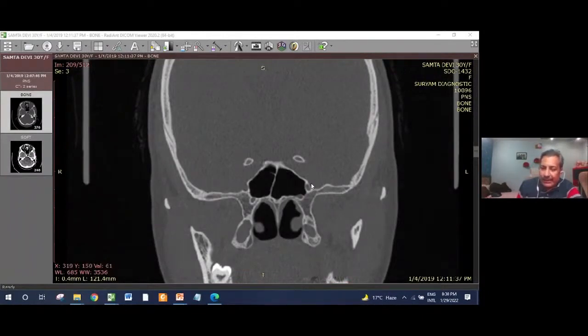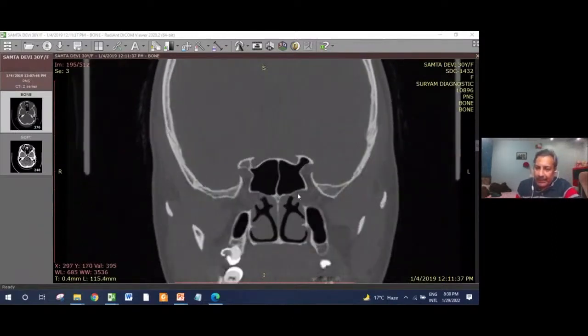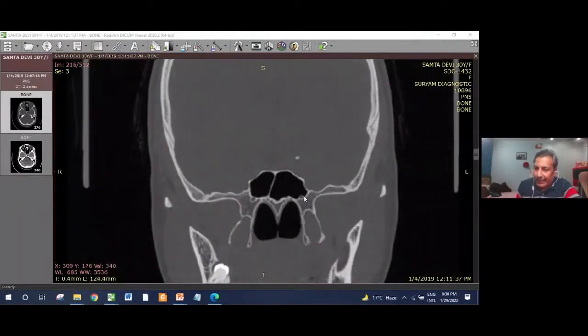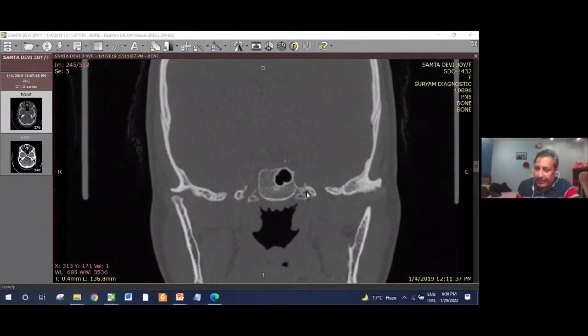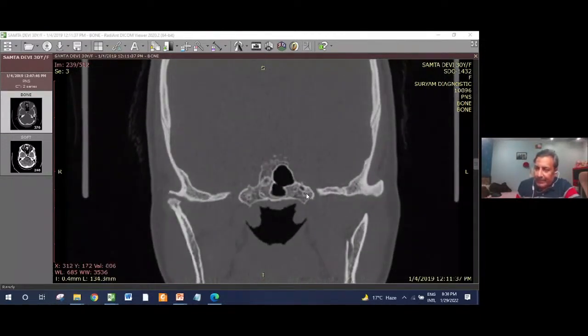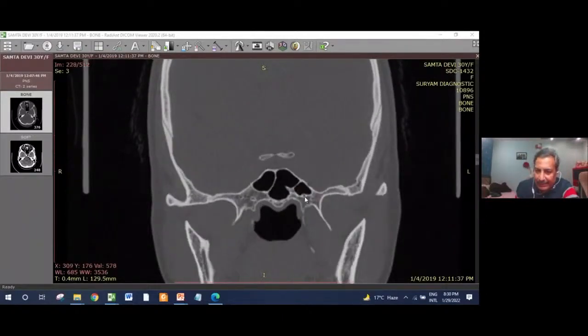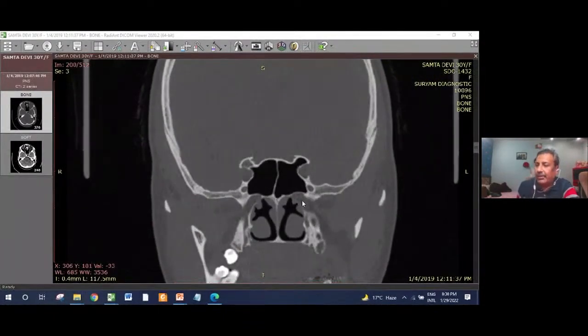And through this region, see these two nerve foramens traversing the medial wall, being the Vidian canal, the Vidian nerve. See this. This is the pterygopalatine fossa here, the Vidian nerve traversing the pterygopalatine fossa. It is coming from behind. See this Vidian nerve, if I follow, the Vidian nerve comes from here, forming in the pterygoid canal where the carotid artery is coming, and the greater petrosal nerve forming with the deep petrosal nerve the Vidian nerve, and then it passes anteriorly into, see this how I am coming anteriorly into the pterygopalatine fossa.